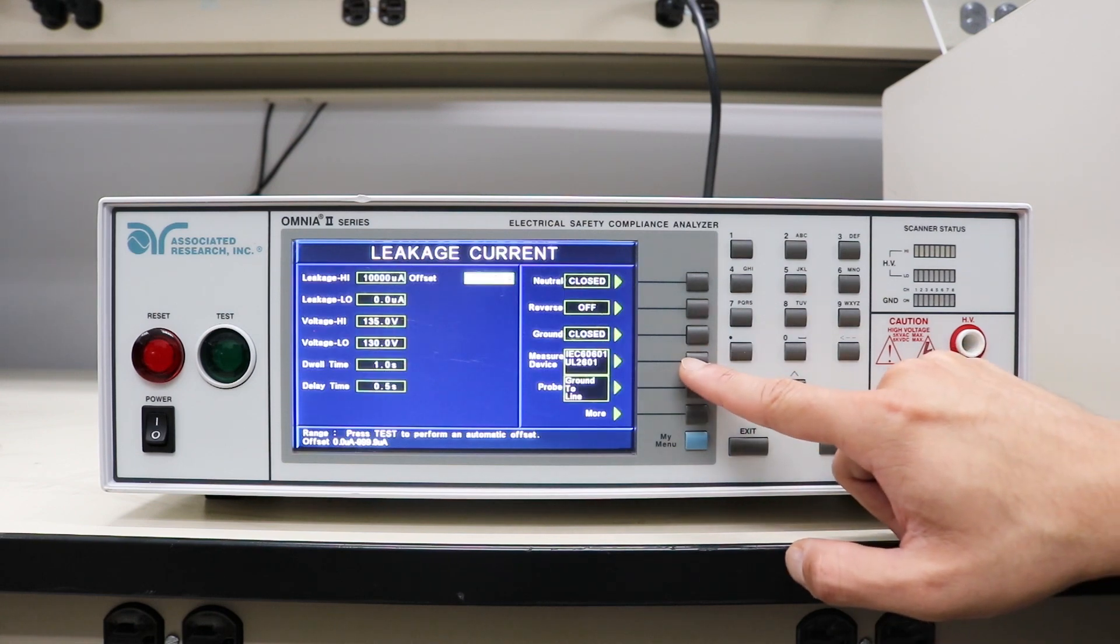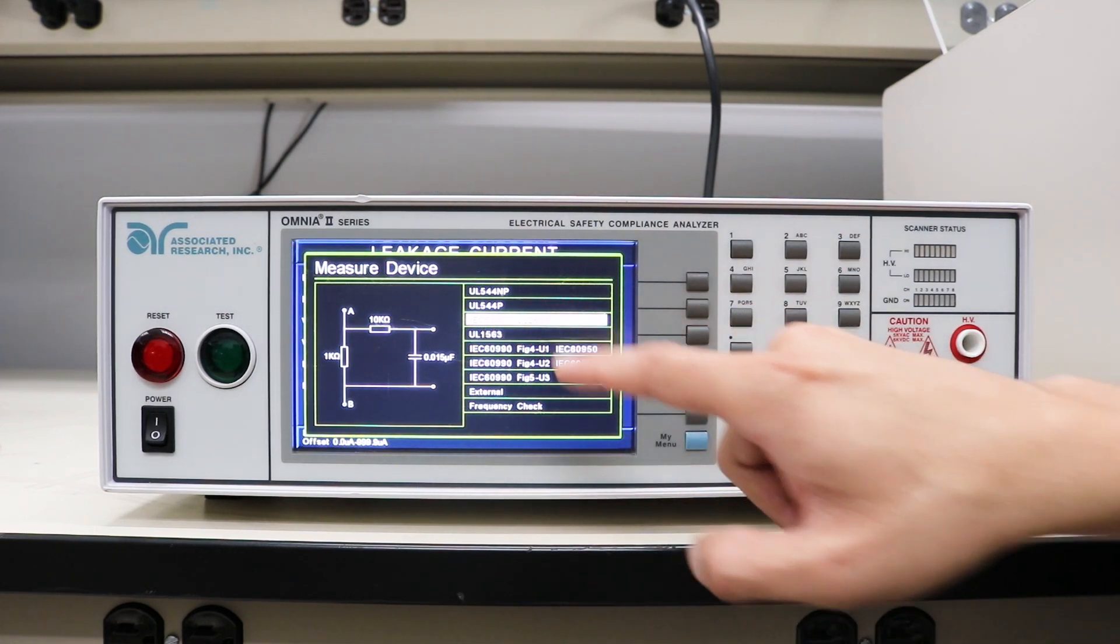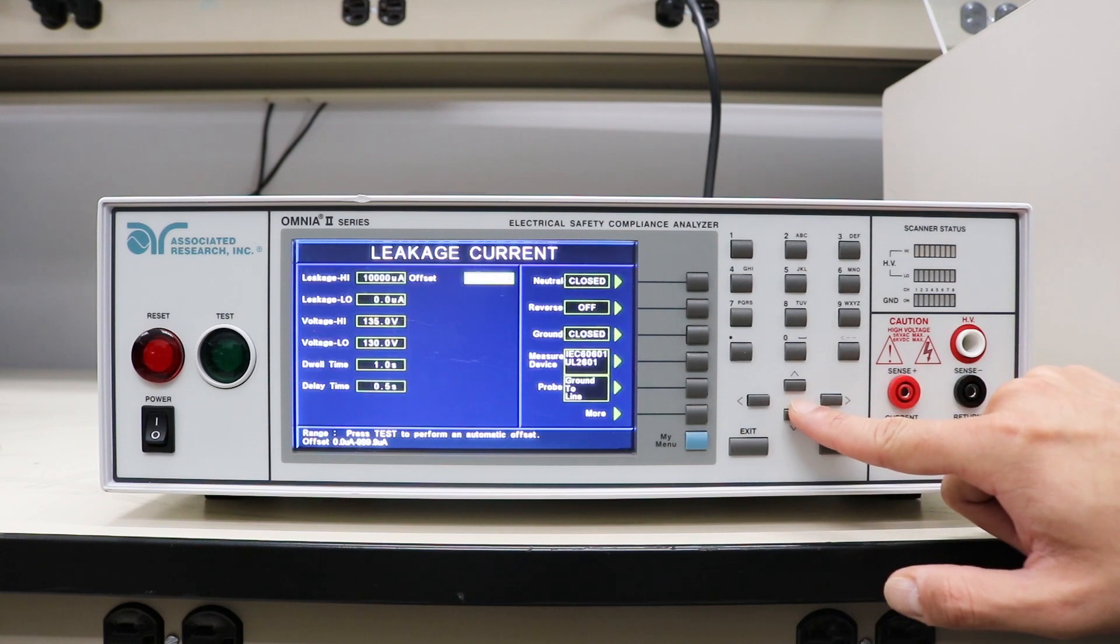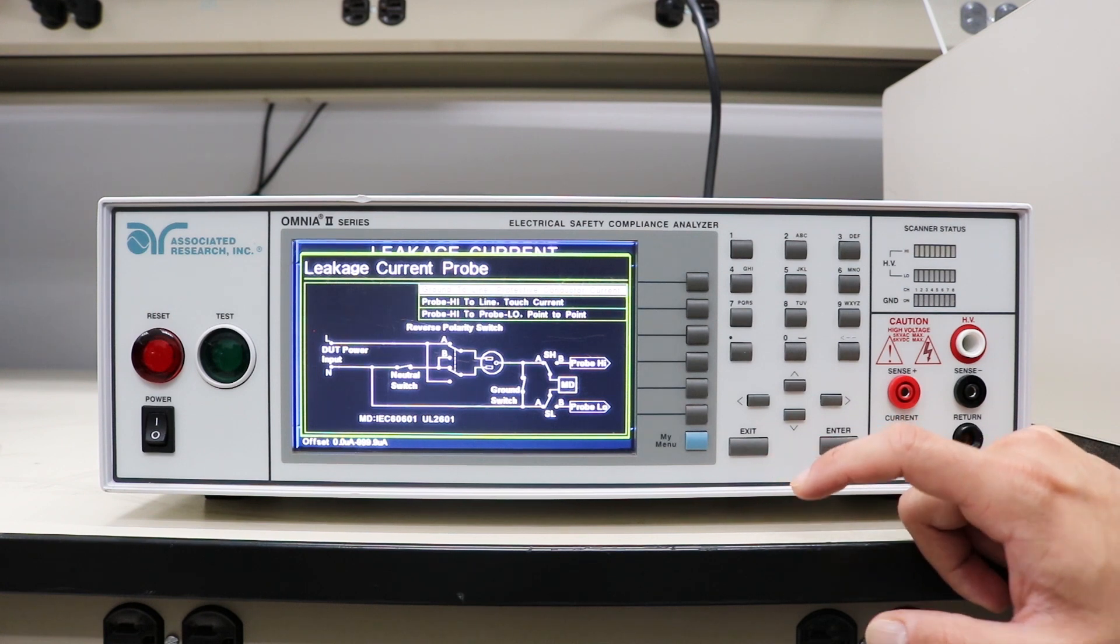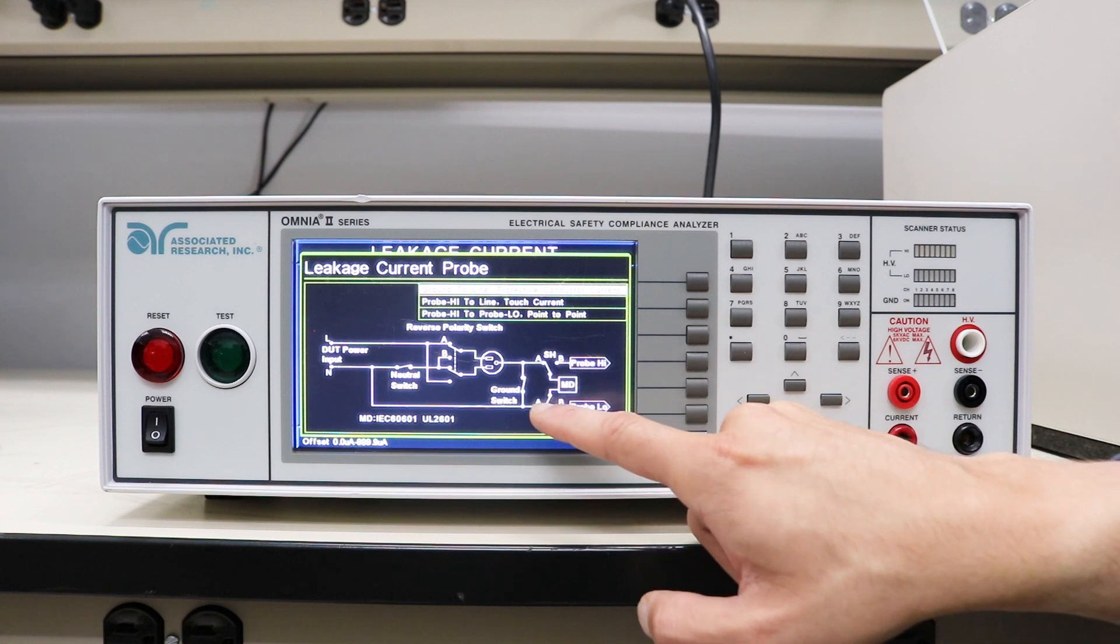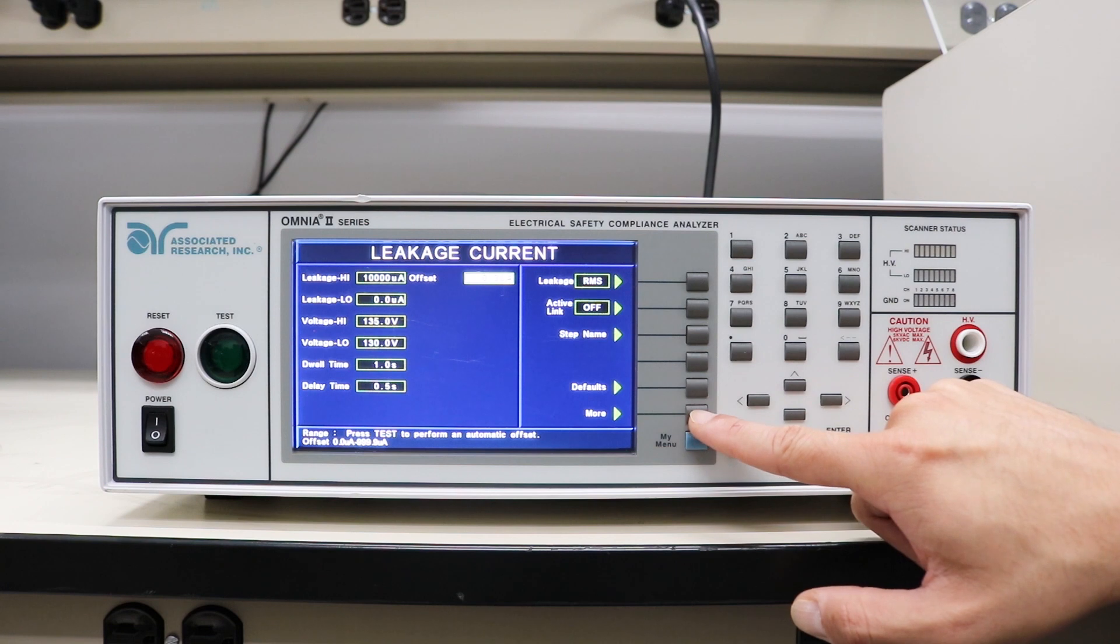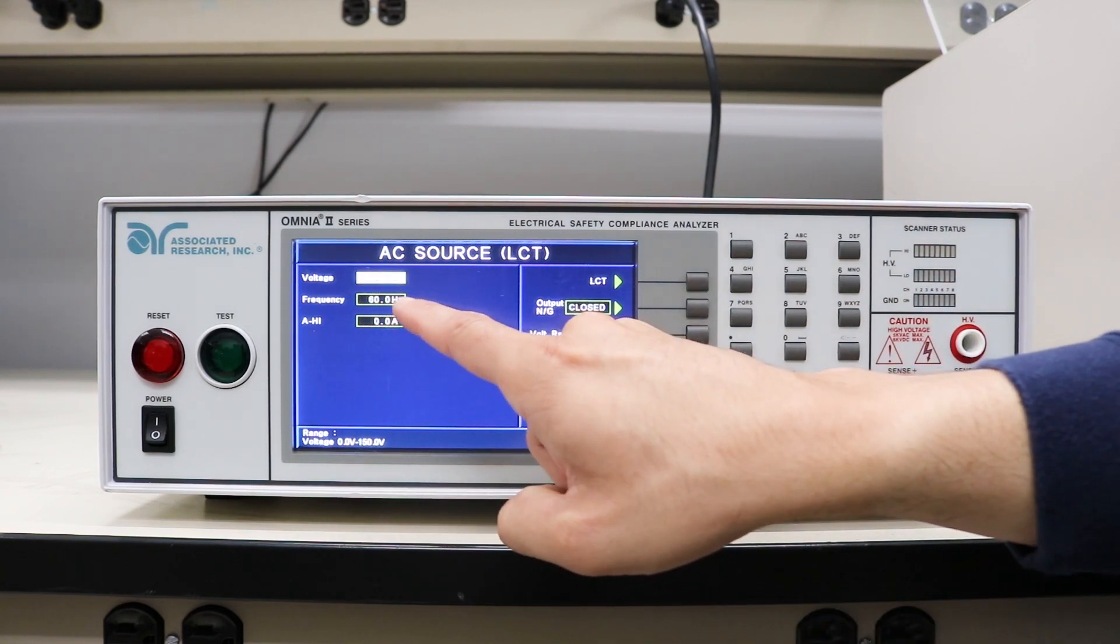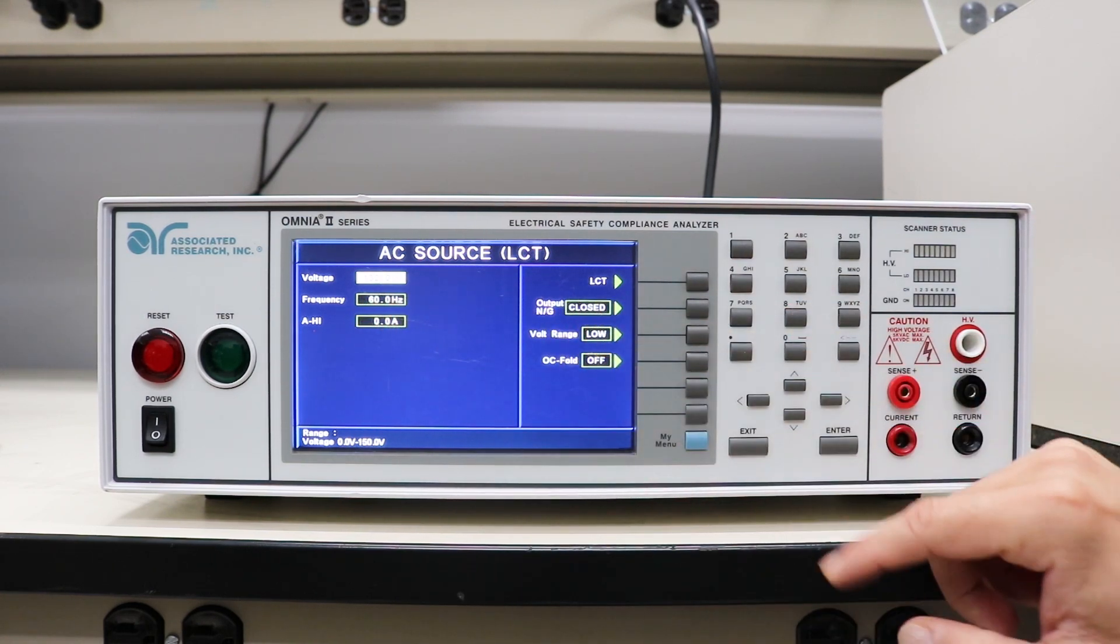We have our measuring device circuit which is the IEC 601 per the test standard that we're testing, the medical device standard. That's followed by the probe configuration. We want to make sure that our MD is placed in the right position between the ground and the low side of the power supply. Lastly, the AC source setup is set to output 132 volts at 60 hertz in a grounded neutral configuration.